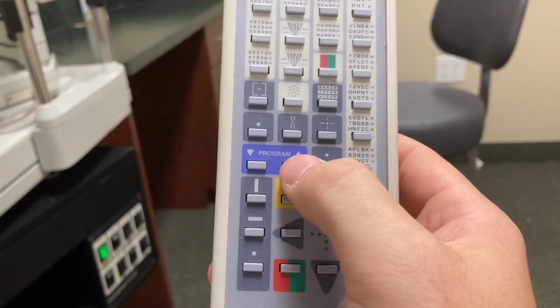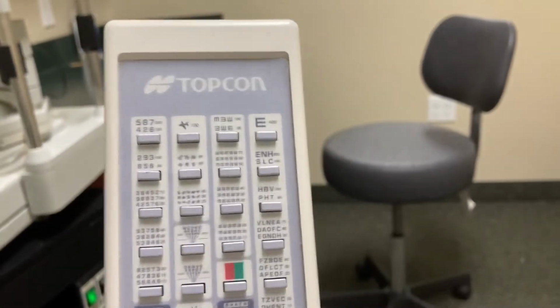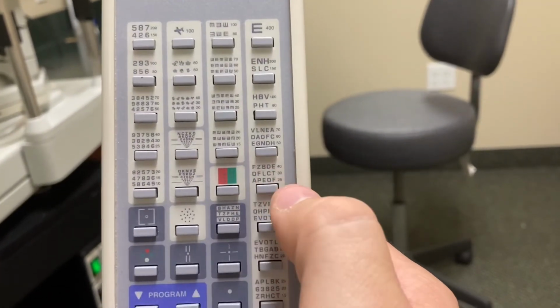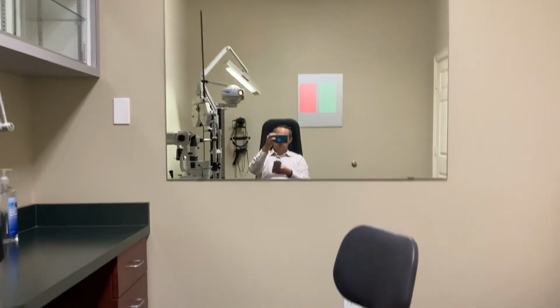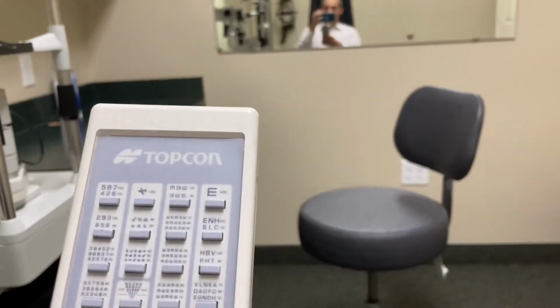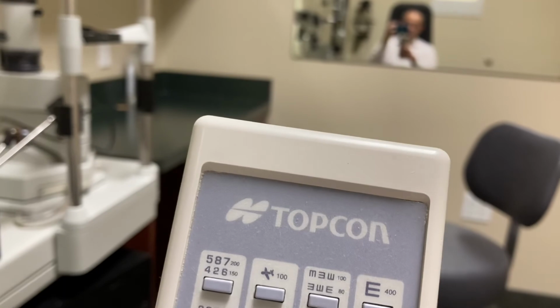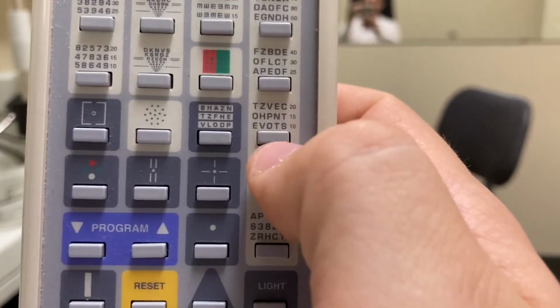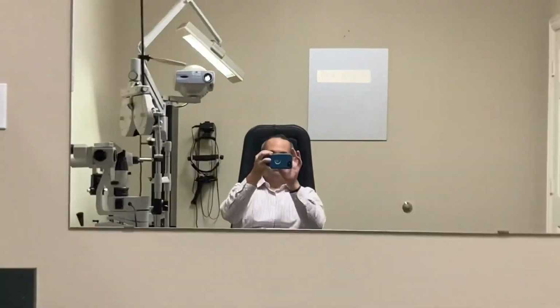If you want, it looks like you can program some things to be your favorites, but usually you open up here to the 40 through 25, and you take away the green red, you go through a refraction, and when you're pushing the end, you can kind of go down to, boop, there we go, to the 20/20. If you give them a single line and see how they're doing. There it is. Can you see 20/20?